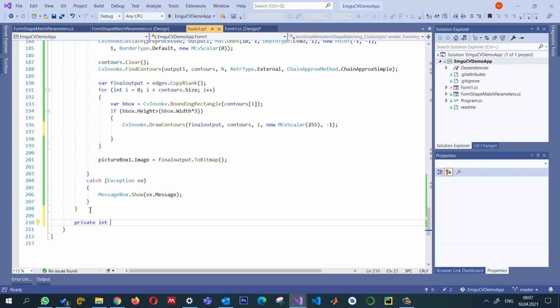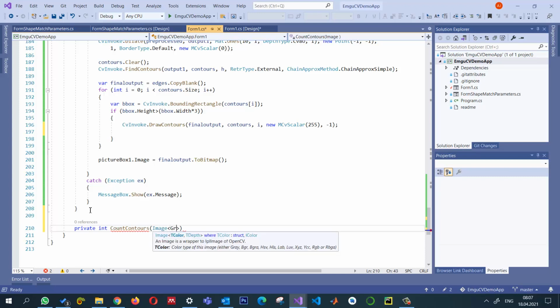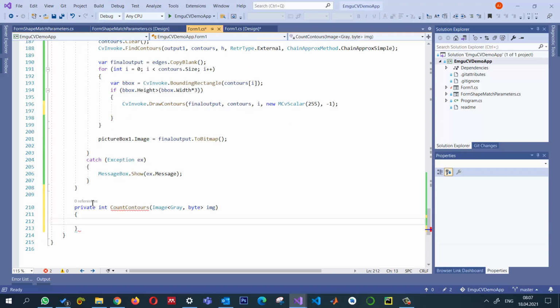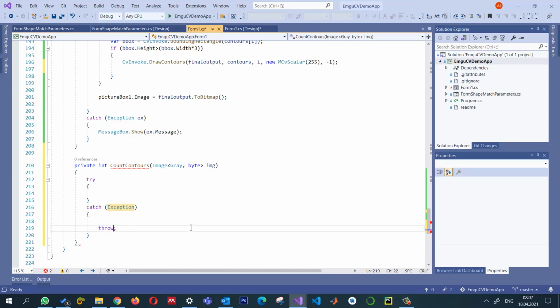So we can say count contours, and we need to pass in an image, actually a gray image, gray, byte. Say img, and inside it let me create a try catch, and if there is any problem we can throw a new exception here, and whatever the error we have, we can pass that exception as it is, ex.message.